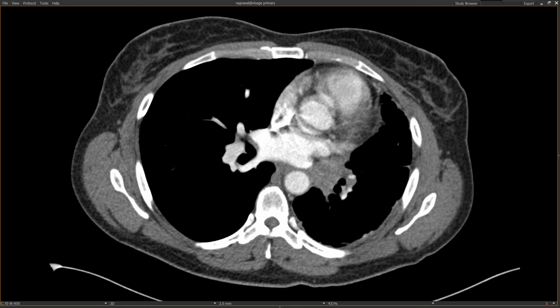In most patients with a histoplasma infection, they get a calcified granuloma in the lung and then calcified mediastinal and hilar lymph nodes. But for some reason in these patients, they have this progressive inflammatory reaction that causes soft tissue to form, and the characteristic finding for these patients with fibrosing mediastinitis is that soft tissue occludes vessels and sometimes even bronchi. In my experience, most of the time, it's the pulmonary veins and the SVC that are affected by fibrosing mediastinitis. But sometimes you can have pulmonary arterial occlusion and even bronchial occlusion.